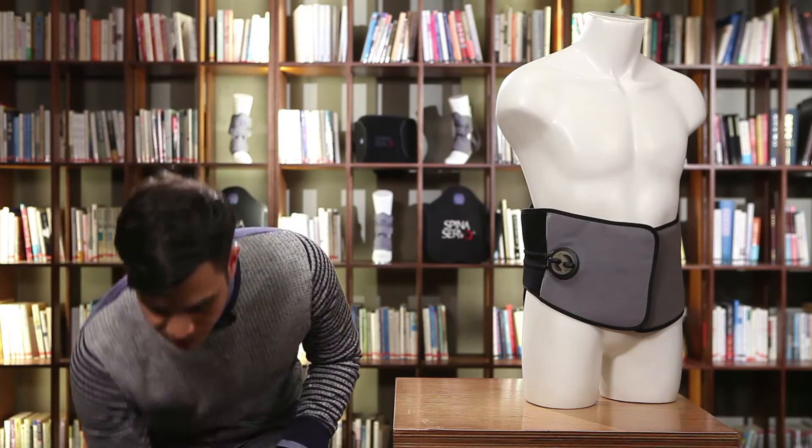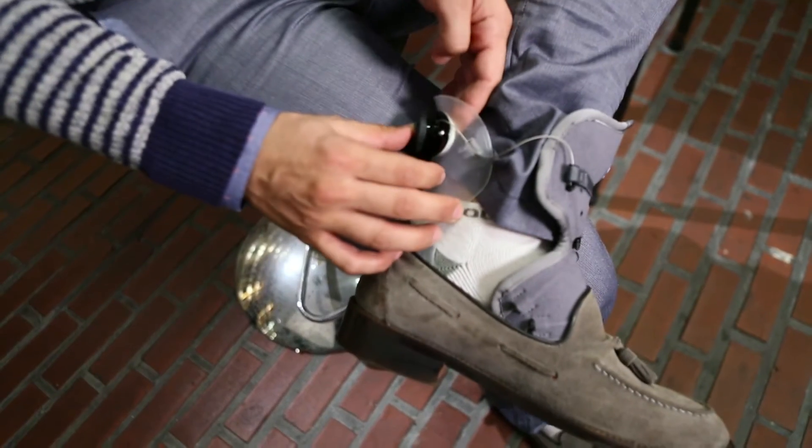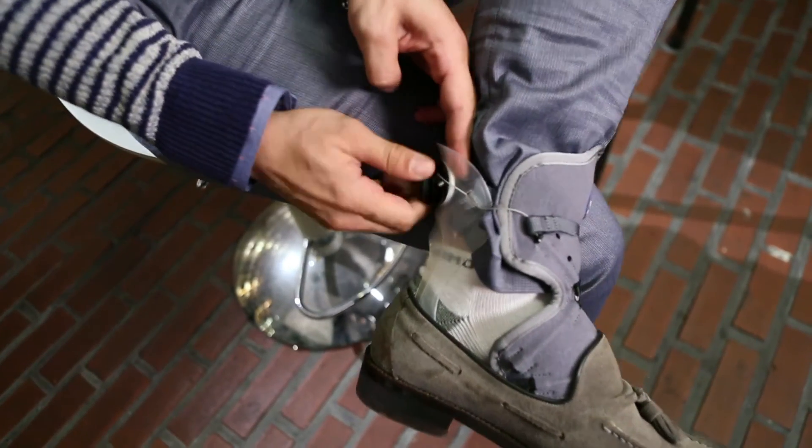Then I put it down on the ground and put my shoe and the AF Servo on. The next step is to push the dial back in until it makes that click again, and tighten it or screw it until it's securely fastened on your foot. See how easy it is to put on and walk on.